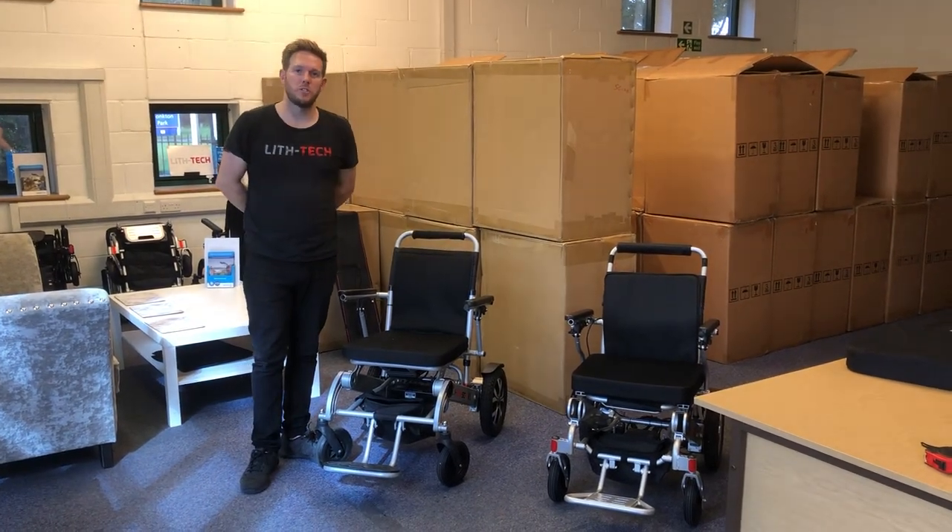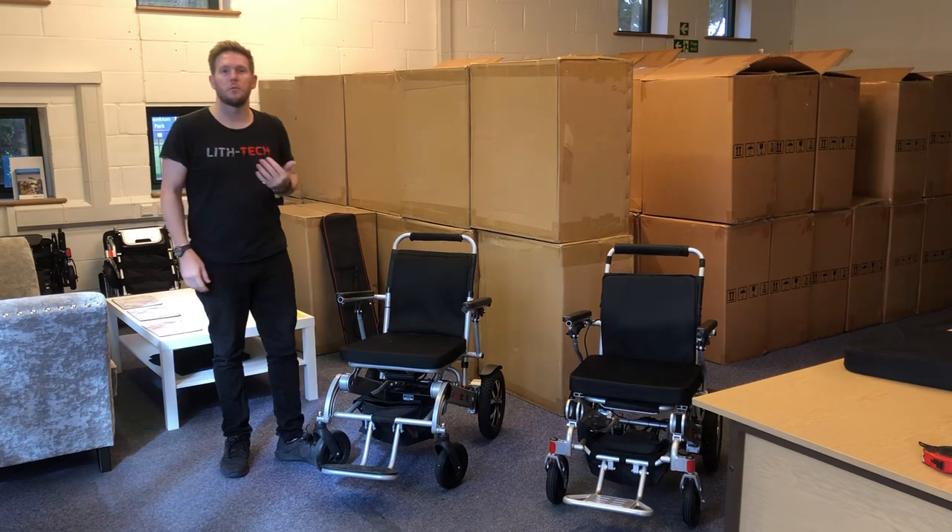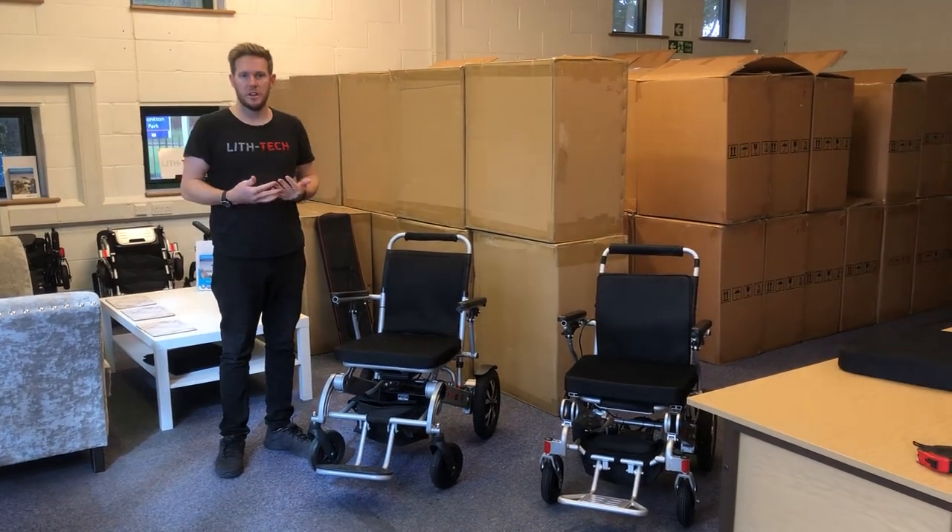Hi, this is Toby from Lith-Tech Mobility. In today's video I'm going to show you the different ways of getting in and out of your chair in the easiest manner.